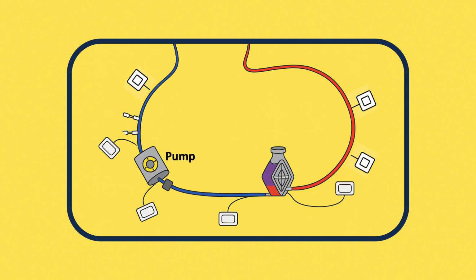Now we have the blood pump. This is a key component. It's usually a centrifugal pump. The flow rate in litres per minute directly determines the blood flow through the circuit, which in turn impacts the degree of support to the patient's oxygenation and therefore organ perfusion.